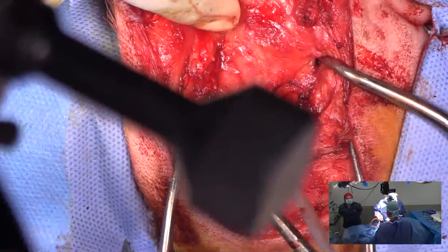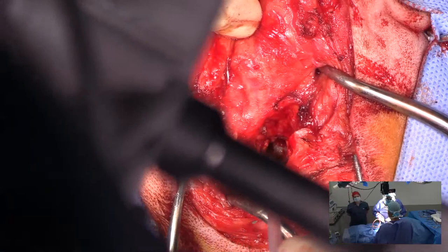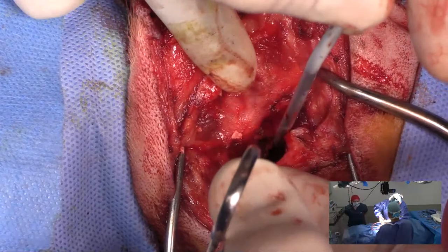So we had a question internally as to what happens if you do a TECA without a bulla osteotomy. The answer is that you leave all that secretory tissue in there, and then you're going to get draining tracts that are going to form down the road. You're going to get draining tracts because you're leaving secretory tissue without any way for it to exit. Does that answer your question?